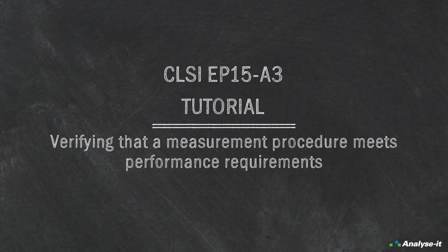In this tutorial, you will learn how to use Analyse-it to verify that a measurement procedure meets performance requirements. You should use this analysis before introducing a new measurement procedure into the laboratory, after maintenance to the measuring system, or upon failing a proficiency test or inspection.